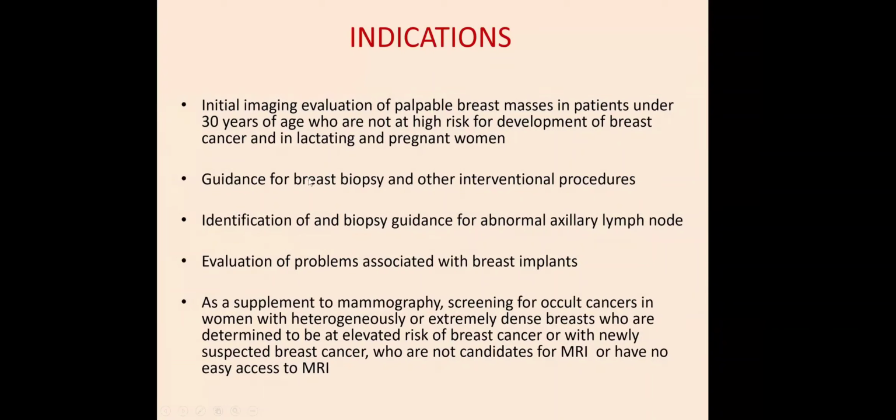Ultrasound can also be used for guidance for breast biopsy and other interventional procedures. Then identification and biopsy of abnormal axillary lymph nodes. Then evaluation of problems associated with breast implants. Ultrasound is also used to assess breast implants and their complications, like rupture.